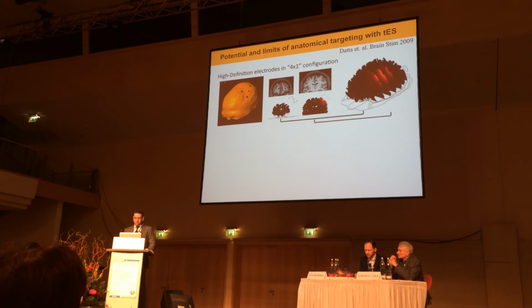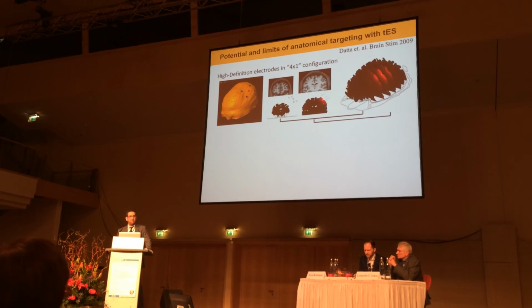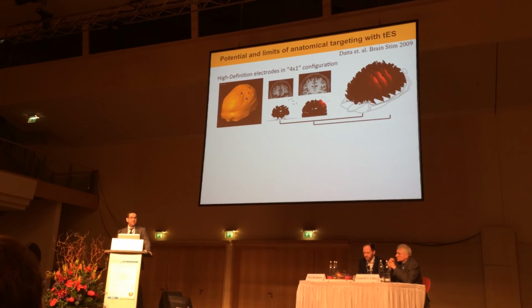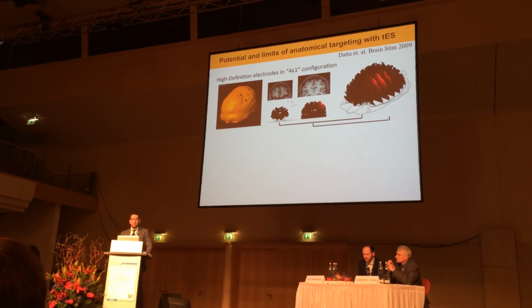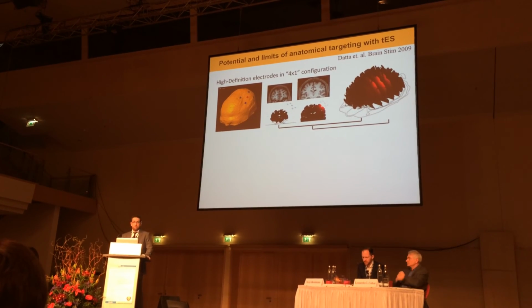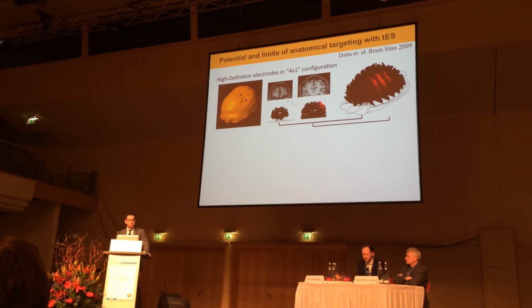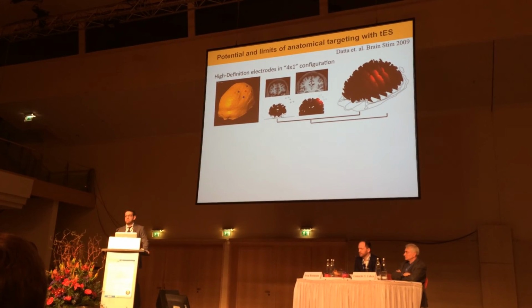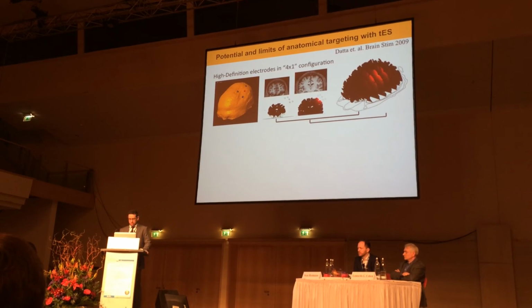Just touching back a little bit on the anatomical, so we've known now for maybe about half a decade that using arrays, almost in the form of an inverse EEG, models predict that you can focalize current to the brain, and there's been several trials using these forms of techniques to try to be focal with electrical stimulation, perhaps approaching the focality that you might get with transcranial magnetic stimulation.